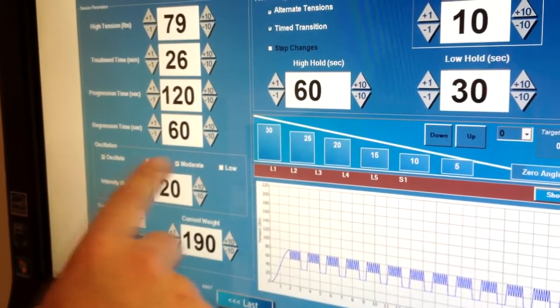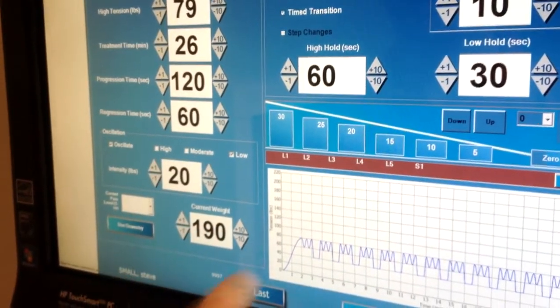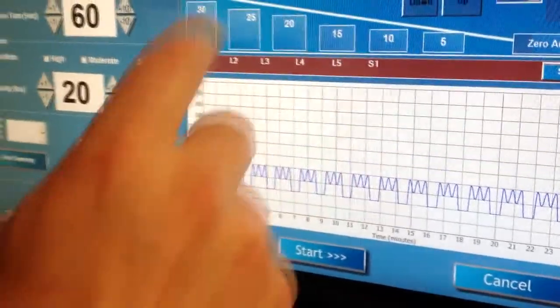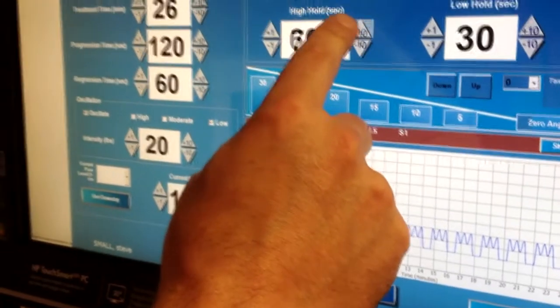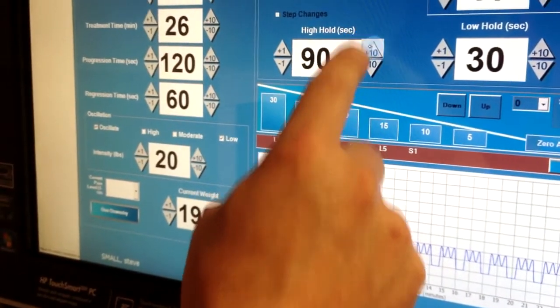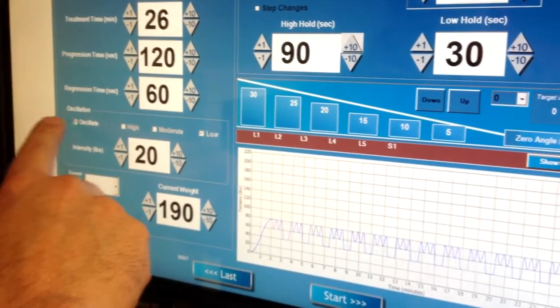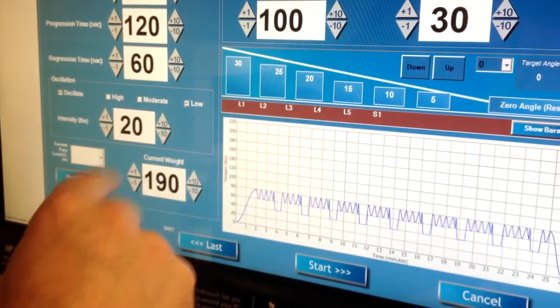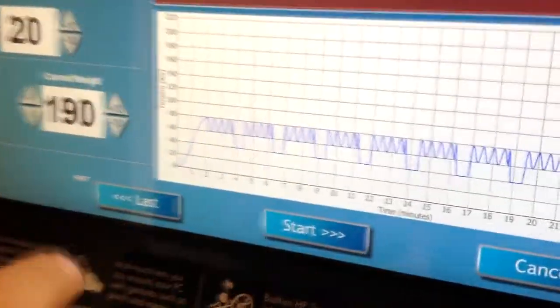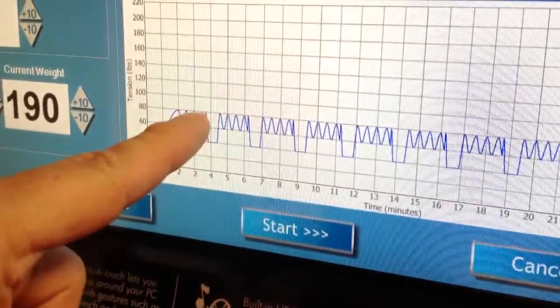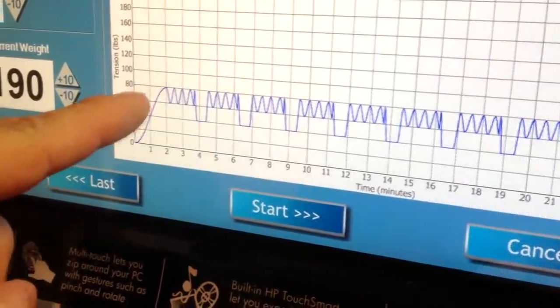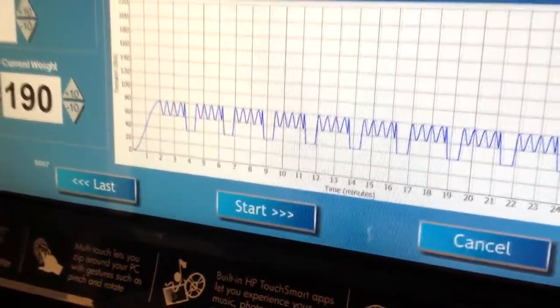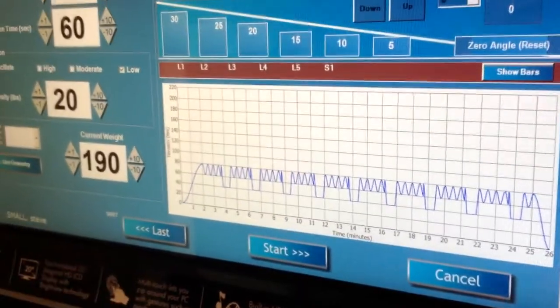But again, if we wanted to go back to our low intensity, if we wanted to increase the amount of time the joint is held open and then mobilized, I can adjust the high hold. And so now I have a joint open for 90 seconds. So a minute and a half, and that gives us roughly four cycles of oscillation when the joint is distracted.